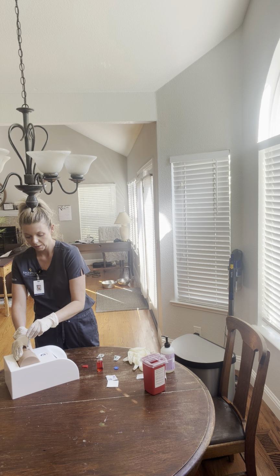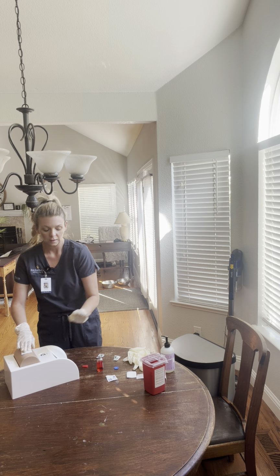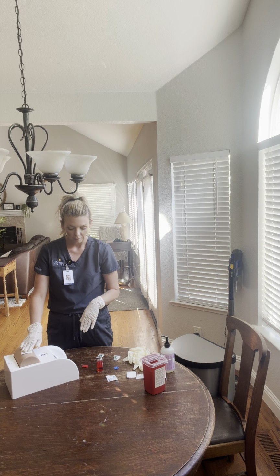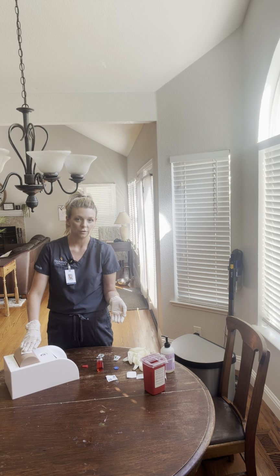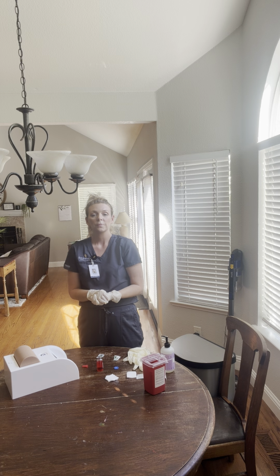Okay, I'm going to pull my needle out, dump that into the sharps container, and I'm going to lightly hold gauze, making sure that I'm not putting too much pressure or massaging the area. If the bleeding continues, then I can let that air dry or possibly leave the gauze on for a little bit longer. So everything looks good. I'm going to continue to monitor my patient for any of the side effects that I mentioned earlier.